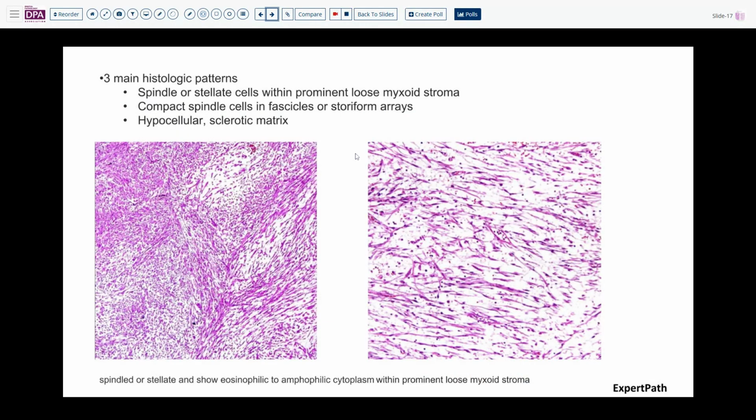So other than the inflammatory part, we have this myofibroblastic part. So in the stroma, we have this edematous myxoid stroma, and then we have this proliferation of spindle cells. So this is a myofibroblast. And in this magnification, you just could not appreciate the open chromatin and conspicuous nucleoli, but I have more images to show you. You just remember this is the spindle cell proliferation in this myxoid stroma.